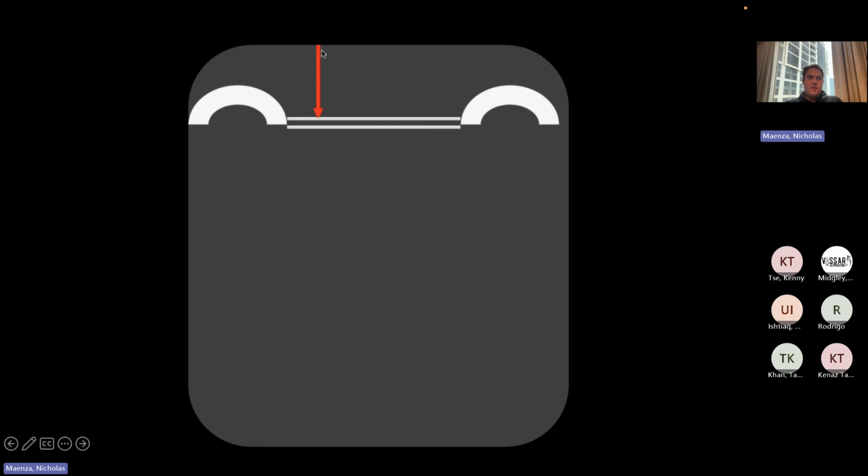So again, when an ultrasound image is created, sound waves will come down through here, hit that pleura, bounce back to the probe, and generate that image of that line. It's important to note that anything below this, so sound waves that go beyond the visceral and parietal pleura in a normal aerated lung, sound waves that go down on this yellow one, go down, down, down, they go past the visceral and parietal pleura, they're just going to scatter and attenuate. So they're just going to go everywhere.